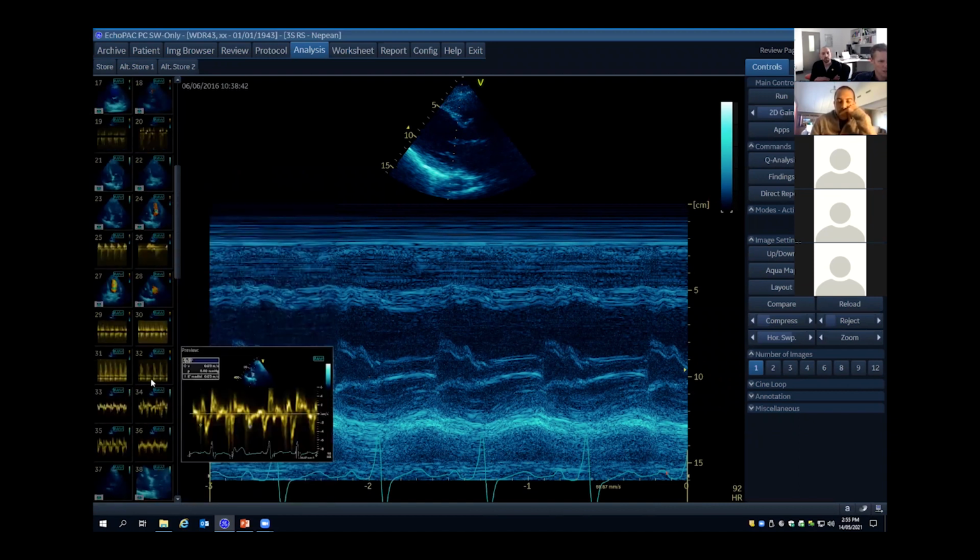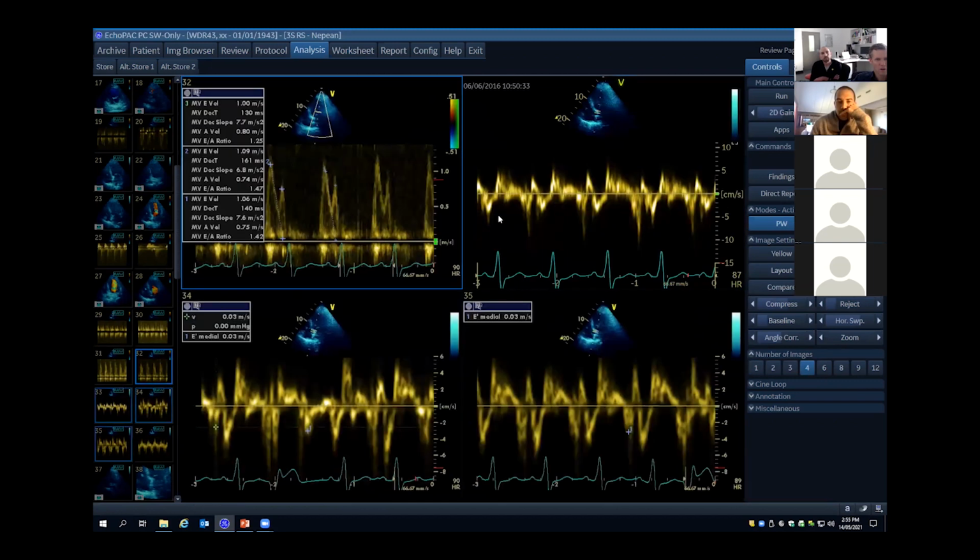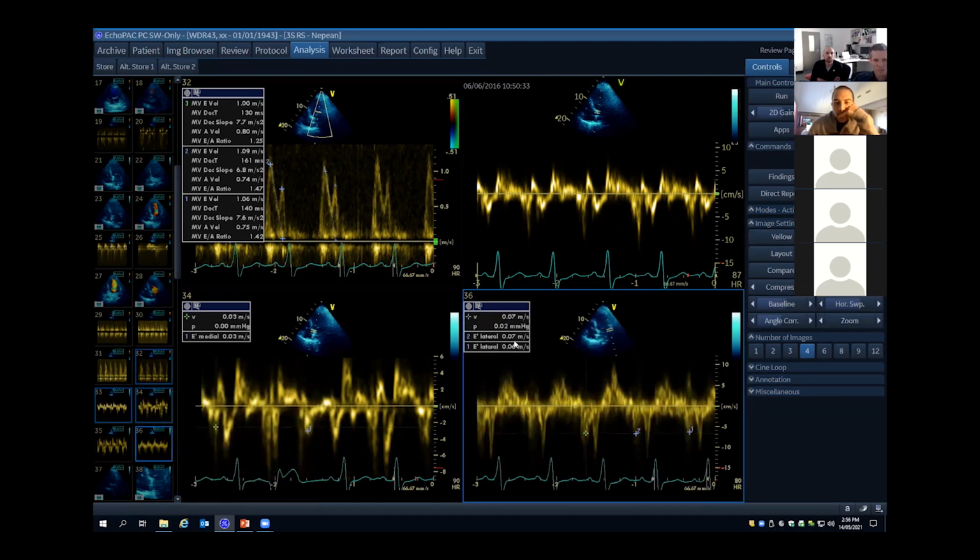And then the mitral valve inflows. So that's a big E, little a. Big E, little a. E value is 1. And then I've got my medial TDI, my medial E prime. It's probably that one there, isn't it? Yep. I've got to measure here. So it's 0.03, and then the lateral is 0.06. So that makes the E to E prime 20. 20 and above.